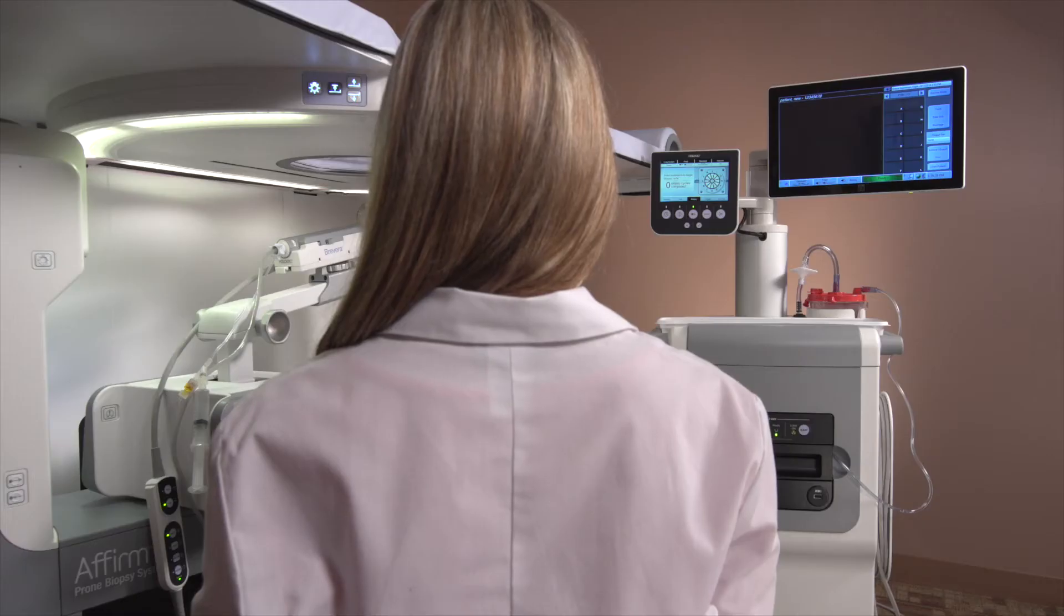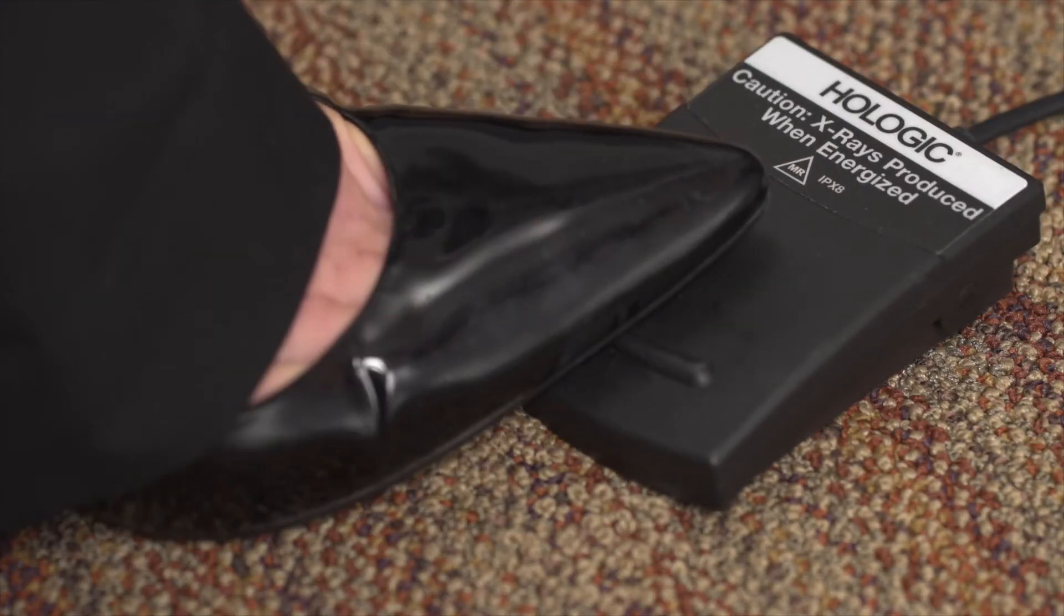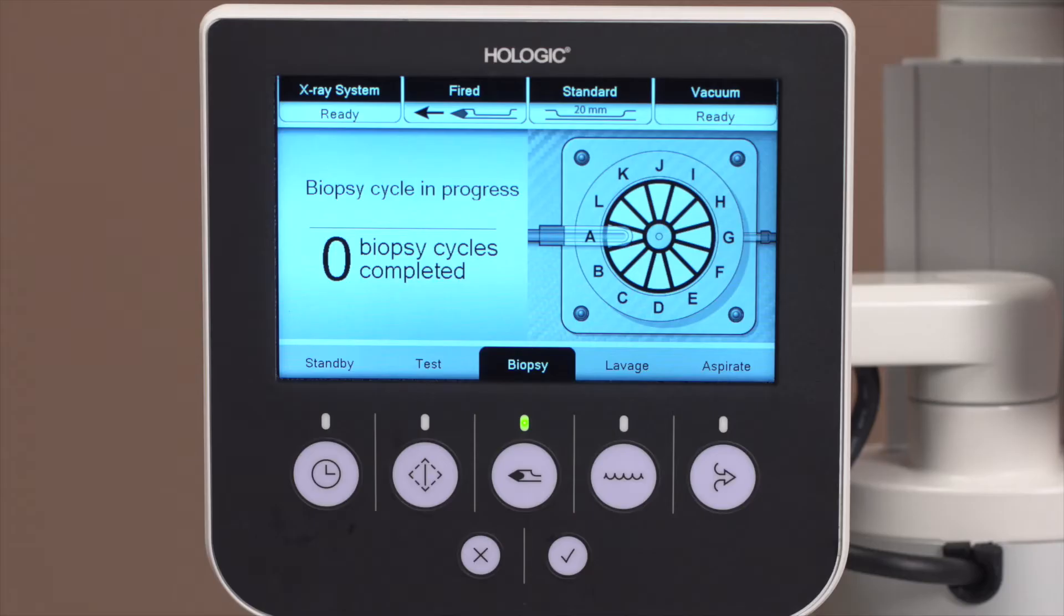To begin tissue acquisition, the physician will press down and hold the foot switch throughout the biopsy procedure for the desired number of samples. The system beeps to indicate it has finished the cutting cycle.